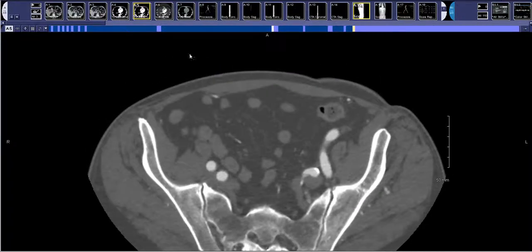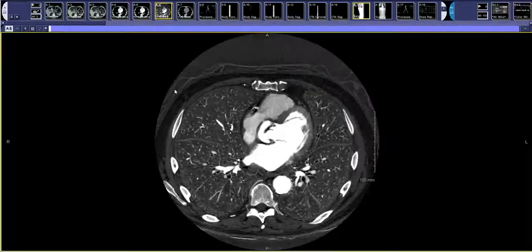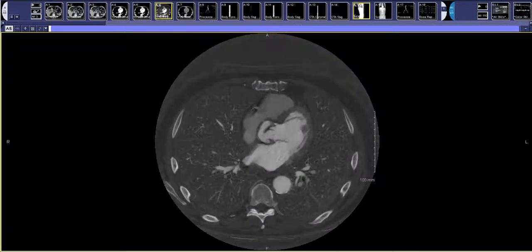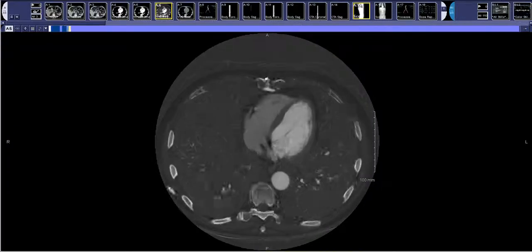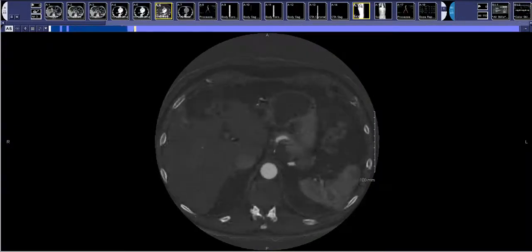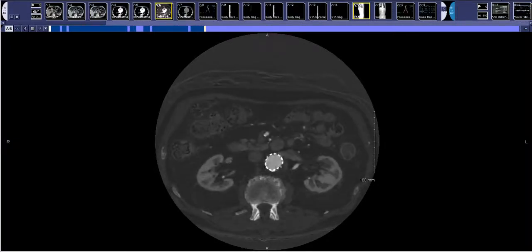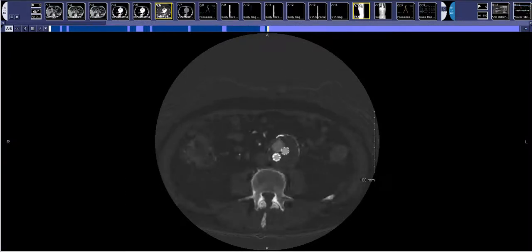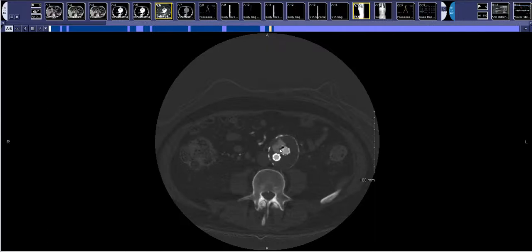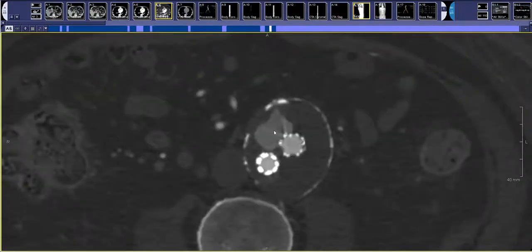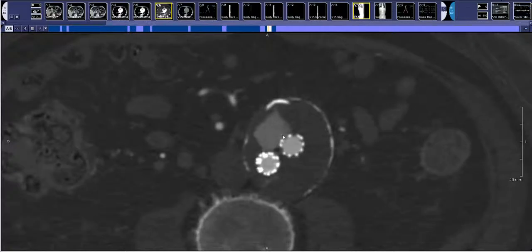From the iodine-heavy or iodine-weighted image, the computer can actually make an iodine map. This is a subtraction image where the only things seen should be things that are enhancing with contrast or bones. If you have an equivocal area where you're unsure whether it's contrast or not, you can see how much this iodine map makes the endoleak pop out compared to just the thrombosed part of the excluded aneurysm sac.